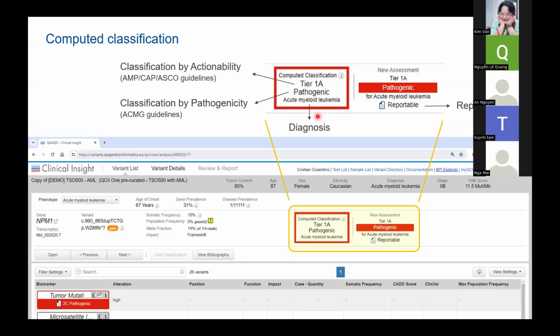We say anything above 20% tumor content is always better, because it avoids the dominance of normal cells. It is also important to consider what kind of samples. If you're working from FFPE tissue, that's another challenge. So tumor content as well as tumor DNA quality are very important parameters to look into.